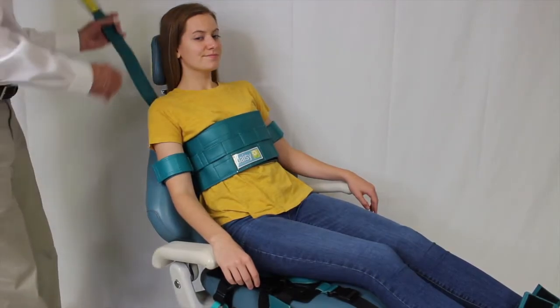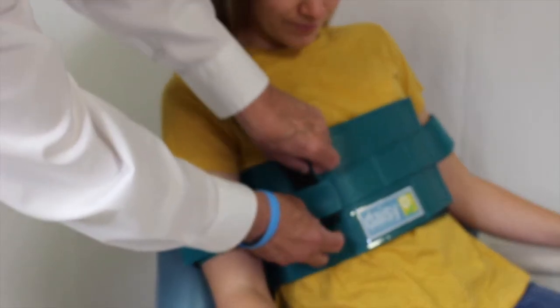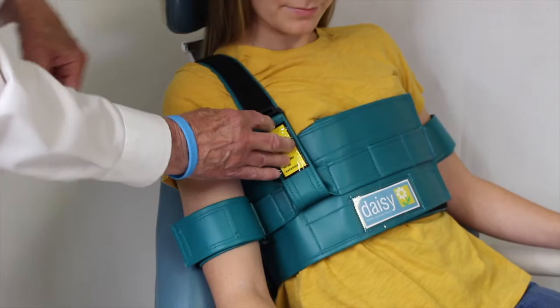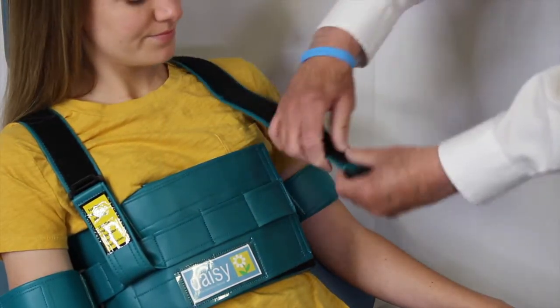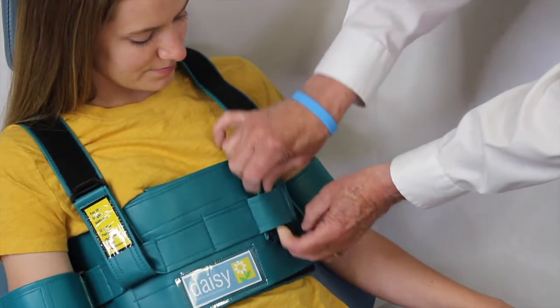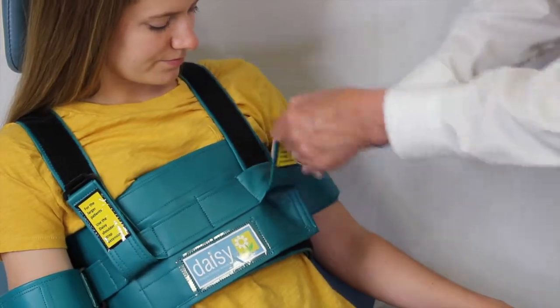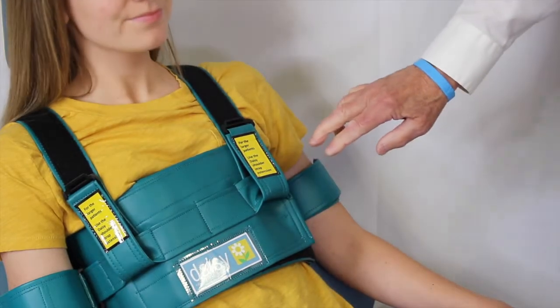Shoulder straps. Position one shoulder strap above the patient's shoulder, insert through the loop in the chest strap. Connect to the Velcro on the strap. Position the second shoulder strap over the patient's shoulder, insert through the loop in the chest strap. Connect to the Velcro on the strap. This will secure the patient in the shoulder straps.